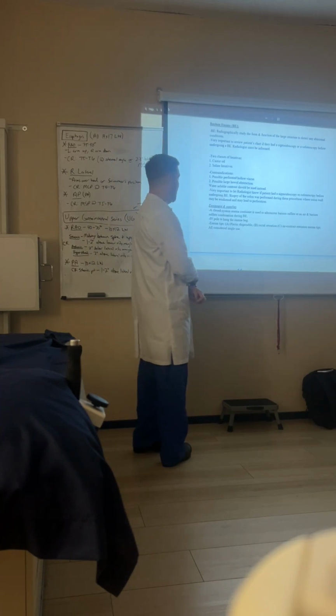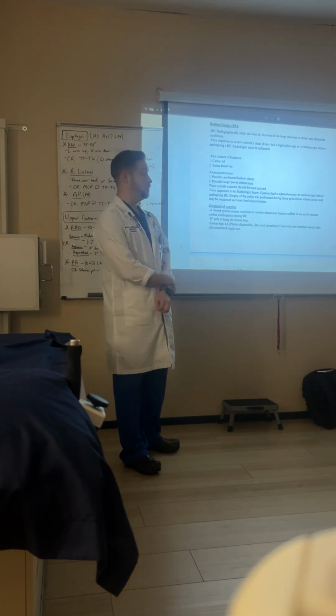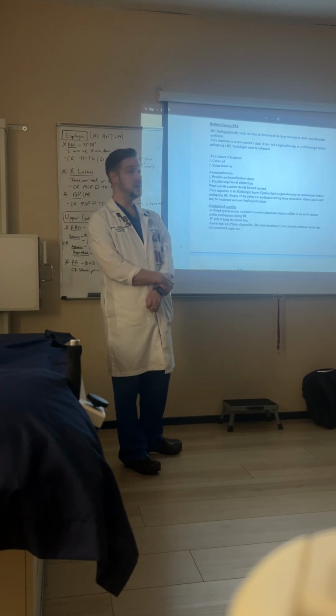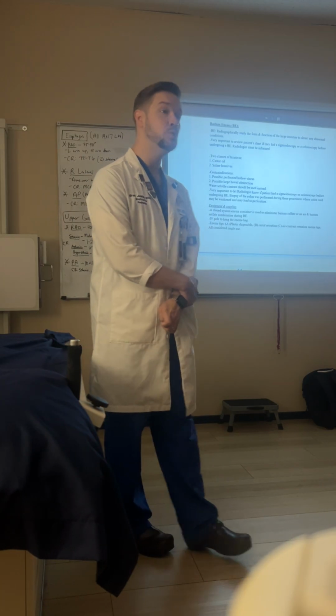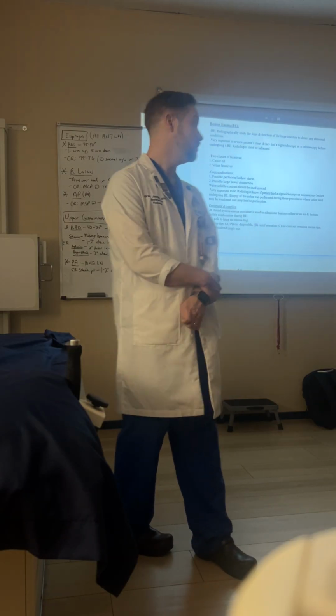The equipment and supplies. We're going to use a closed system, thank God, because you don't want any part of this system open for this procedure. You know what I mean? Because you're going to get poo-poo on you. That's what I mean.